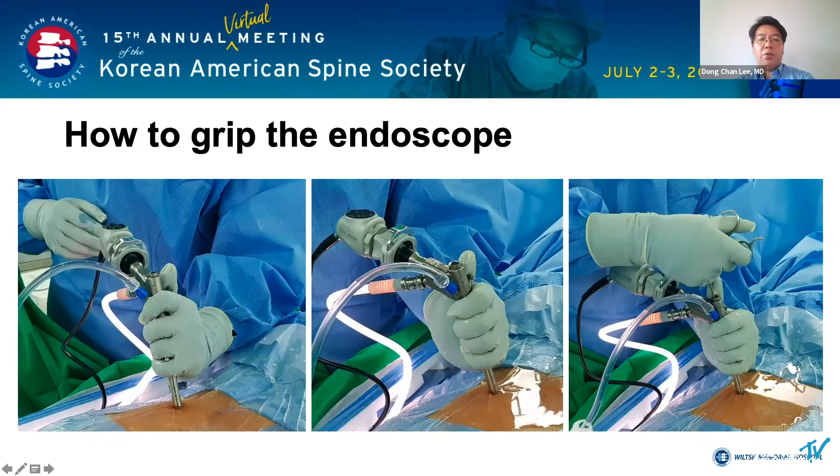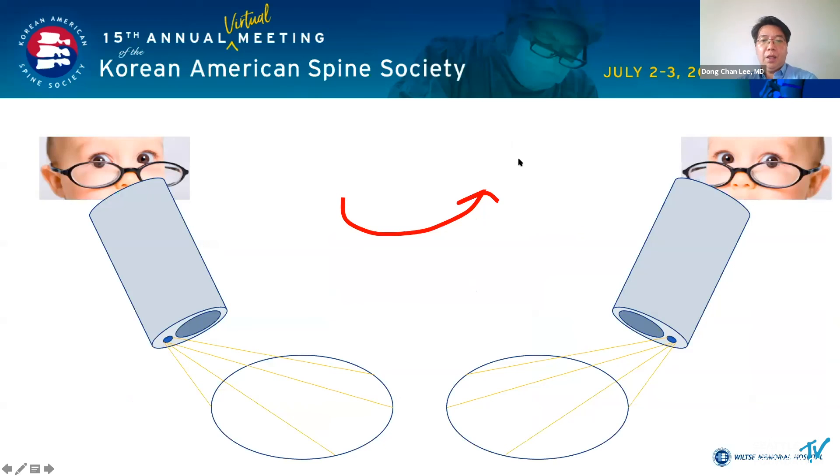You grip the endoscope like this. The depth of the endoscope can be adjusted with the thumb and index finger. The endoscope has an angle of 10 to 25 degrees, so surgery is performed while turning the endoscope in the direction you want to operate.